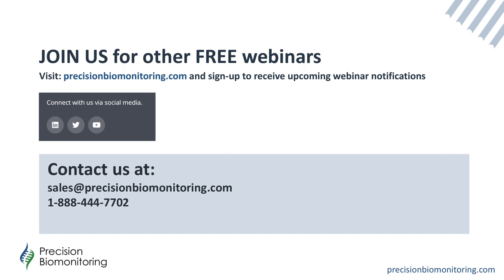Okay, great. One more question here in the question box. Do you have an idea of what the false positive rate is when actually used in the field? So based on our clinical testing that was submitted to Health Canada, which is certainly a smaller number of samples, but representative of what we hope that performance will be, we did not have any false positives on either our cross-reactivity organisms or our negative clinical test samples.